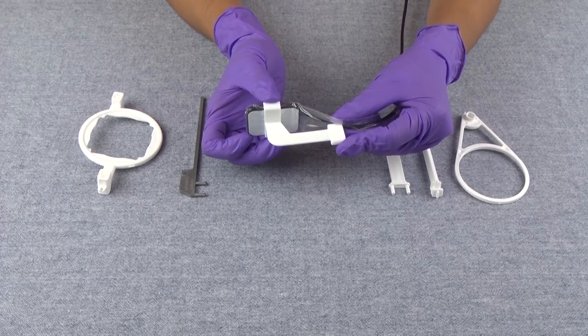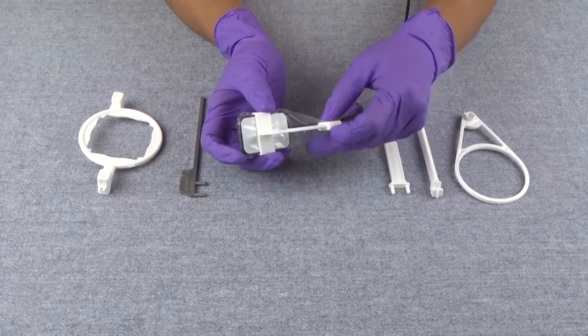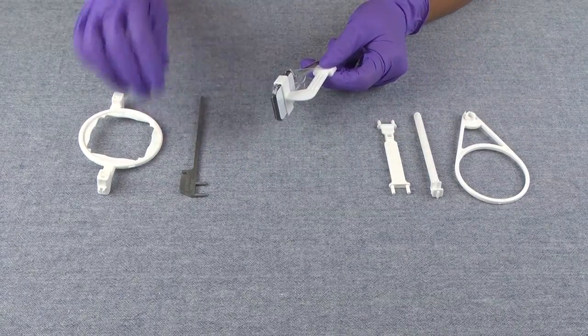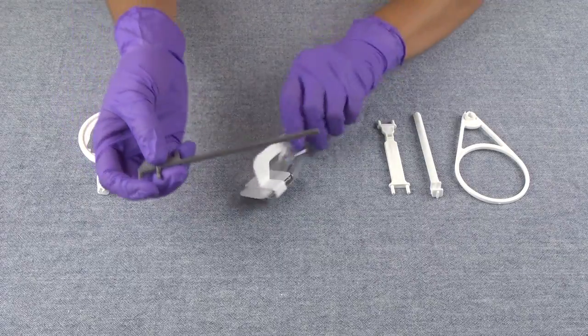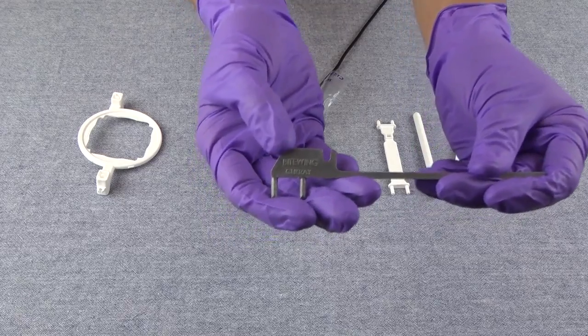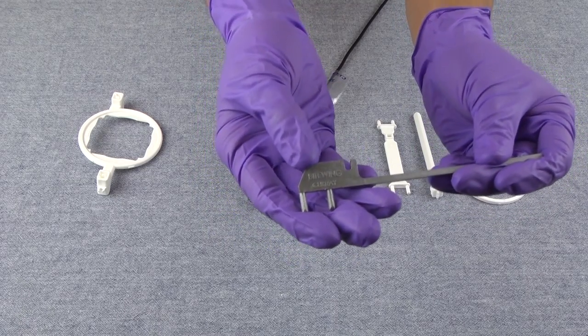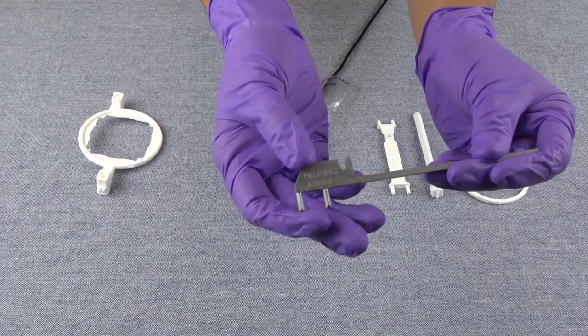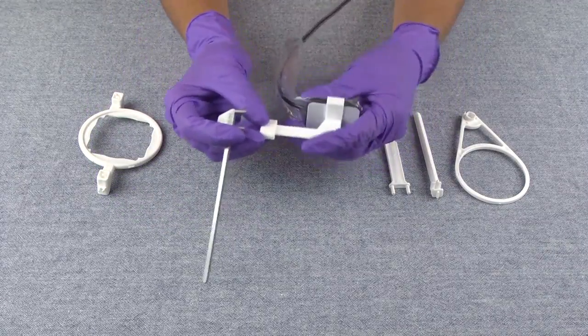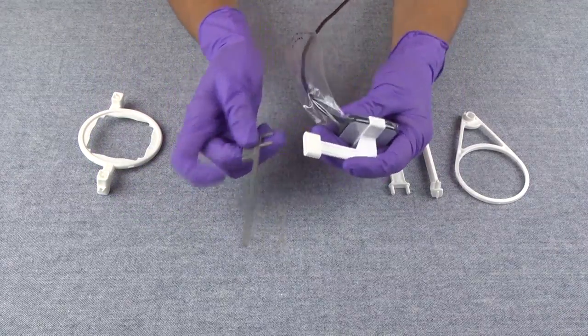It works very similar to a tab. But if you want to use an aiming rod and a ring, you can do that also. For the paralleling guide system, you want to find the rod that is labeled bite wing. Once you find the bite wing rod, you're going to take the pegs on that rod and place them into the holes on your bite piece.